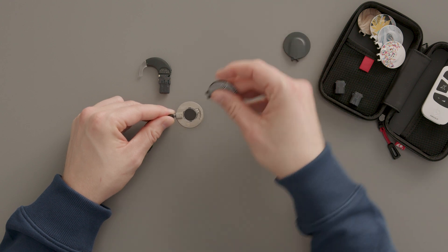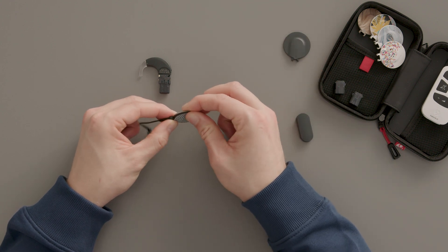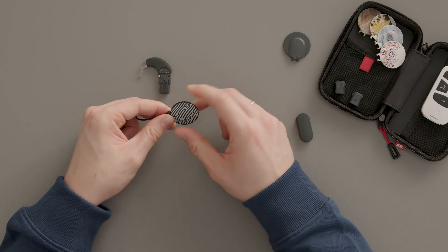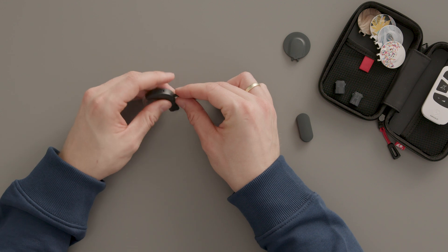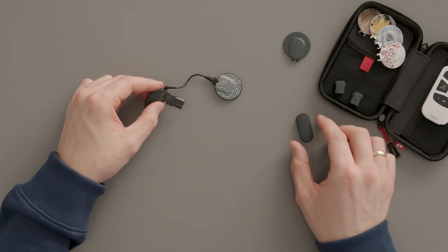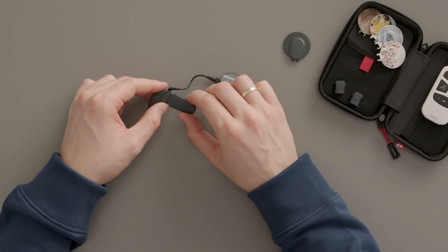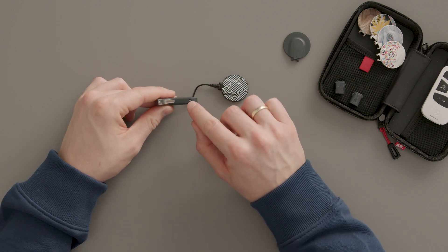Attach the coil cover starting from the side of the socket. Gently press down around the edge of the cover until it is completely closed. Plug the new coil cable into the audio processor, noting the correct orientation of the coil cable plug. Then slide on the battery pack cover. And if the audio processor belongs to a child, lock it into place.